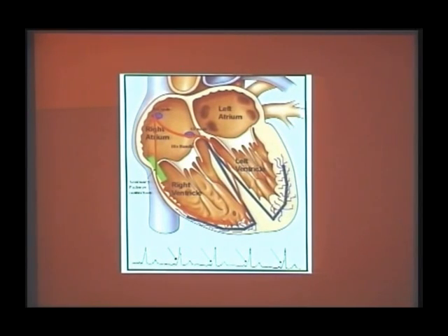So actually the WPW syndrome ECG complex is a fusion complex of depolarization fronts coming through the accessory pathway and through the normal pathway. The initial portion of the QRS complex is rapidly reaching the ventricle, but then getting conducted slowly. That's why your PR interval is short, you will have an initial delta wave.